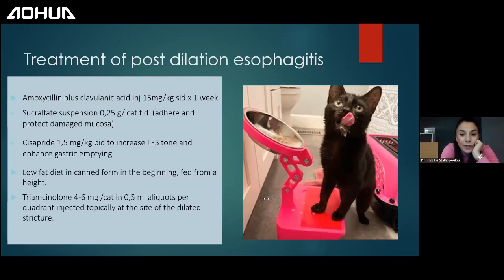Thank you very much for attending, Anna, as well. So, how long after the operation is it allowed to feed, and what? We feed them, as you see here with the cat, as soon as they're waking up, 2 or 3 hours after the operation.